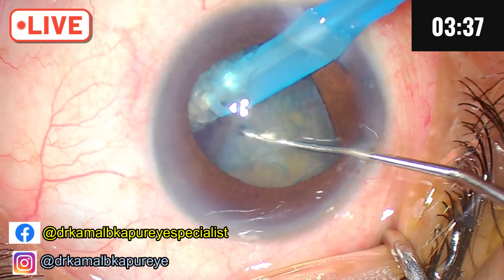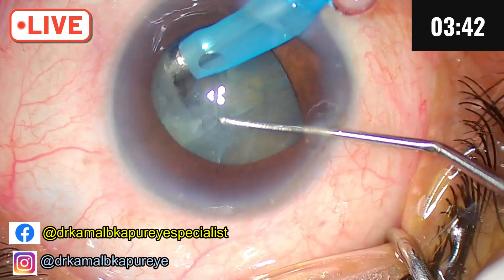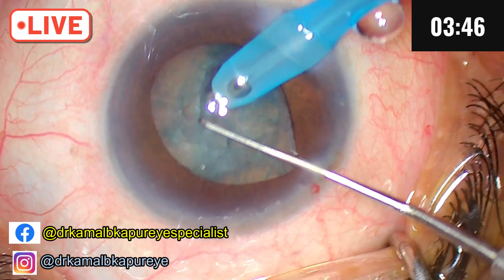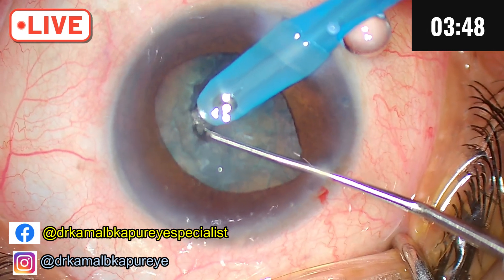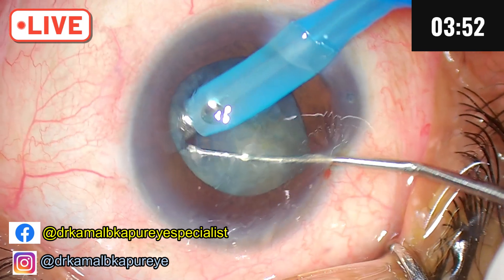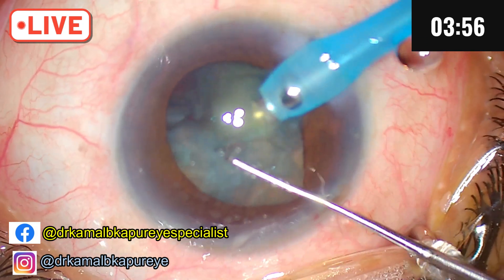So we create a chop. Whenever you have an occlusion in these cases, I don't want the intraocular pressure to rise, because whenever there is an occlusion of the phaco tip, the pressure rises. So when you have an occlusion, after some time, give a break. I have given a break.